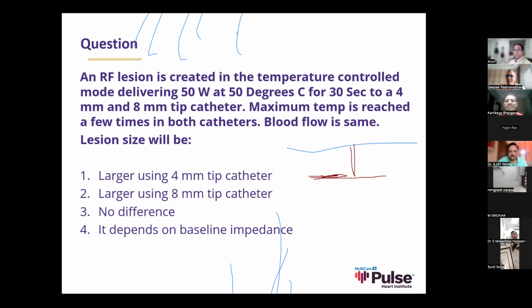So we have one more question in the chat, that is: if 20 watts takes the temperature to 50, why don't we consider it job done, as it is actually the temperature that's doing the job, and tip temperature is the only surrogate we have?